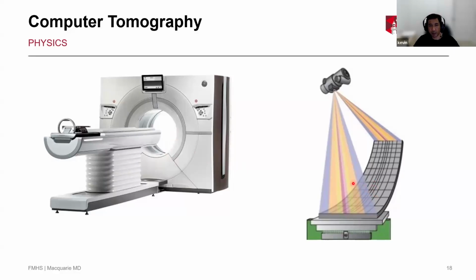So Siemens went for speed, and to increase the speed, they actually had 2 of these things at 90 degrees to each other, okay? GE went down the track of saying, we should improve the detector quality. And they produced what they call the gemstone, which actually used more of the radiation to create the image, which meant that you can have less dose.